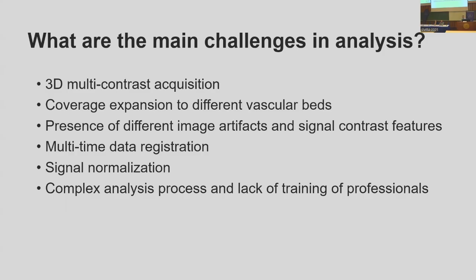For MR, I think we're very used to the fact that there are a lot of artifacts, and the signal contrast can be changed so easily by tuning your imaging parameters here and there. Each of these leads to some variations in signals that you have to deal with.